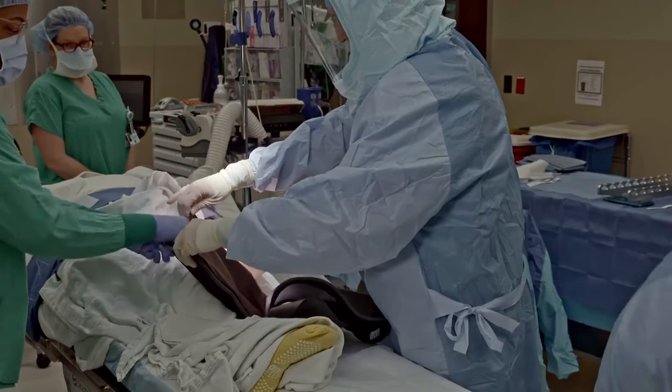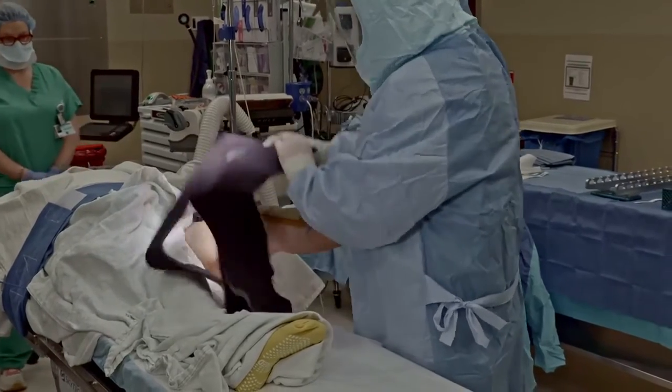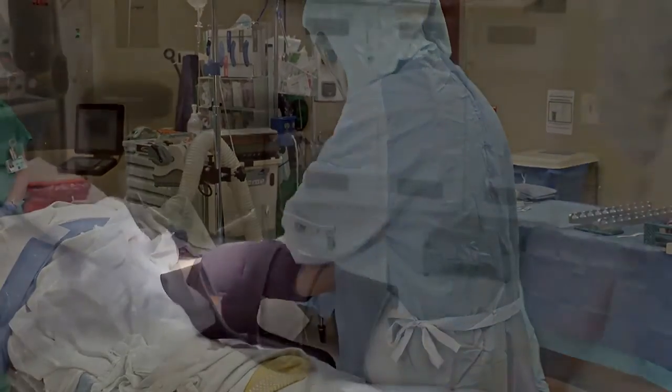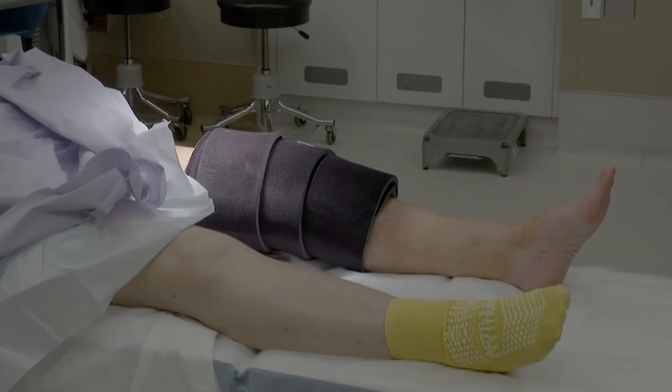You may choose to use ice, and ice can be placed in a compressive wrap directly over the incision in the operating room. Some people may also choose to use a compressive stocking, which can also be placed directly over the dressing following the surgical procedure.